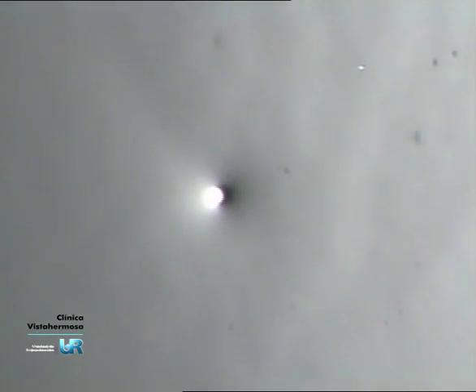The blastomere appears with plain circular edges, cytoplasm is broken, the drop is retracted, and the nucleus appears extended for few seconds and disappears as soon as the fixing drop dries completely.